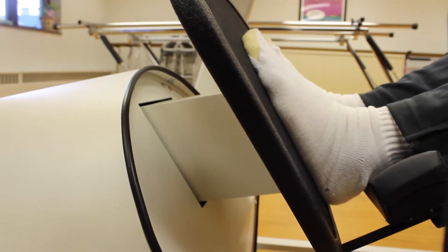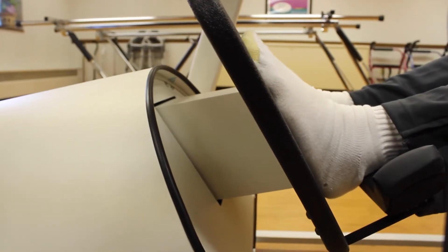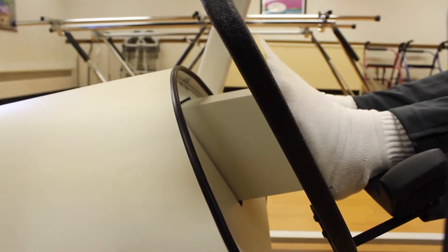leg pressing, things like that. So the option of the VibeTech One for us to push hard through the legs and back — they've really enjoyed that challenge. One of the gentlemen being seen right now puts it on level five with almost the maximum amount of weight and he's pressing against it.